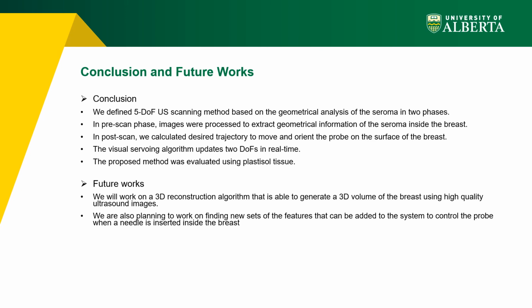We are planning to work on a 3D reconstruction algorithm that is able to generate a 3D volume of the breast using high-quality ultrasound images. We are also planning to work on finding new sets of features that can be added to the system to control the probe when a needle is inserted inside the breast.